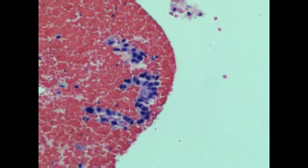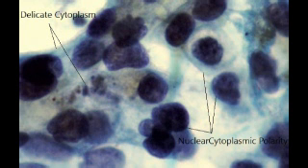The cells are forming a ball, where the nuclei have variable shapes and variable sizes, and there's loss of polarity where they're all over. They don't have a specific direction. So these are very common and striking features of an adenocarcinoma. And of course, you might be hearing terms like rosette, acini, ball. These all refer to the formation and how those cells form, like the gland formation, as we see in this case.